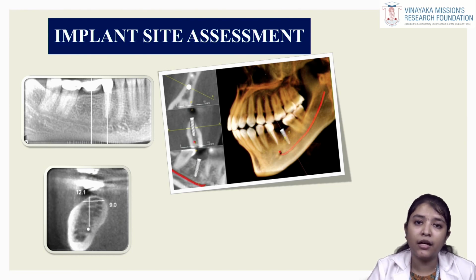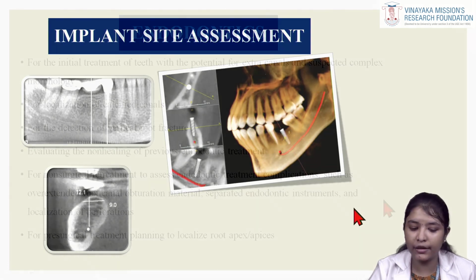And by planning what height and width you can give it to the software in the implant system software. After that, it will give us the implant planning, where you can place it in the region where you want to place the implant.